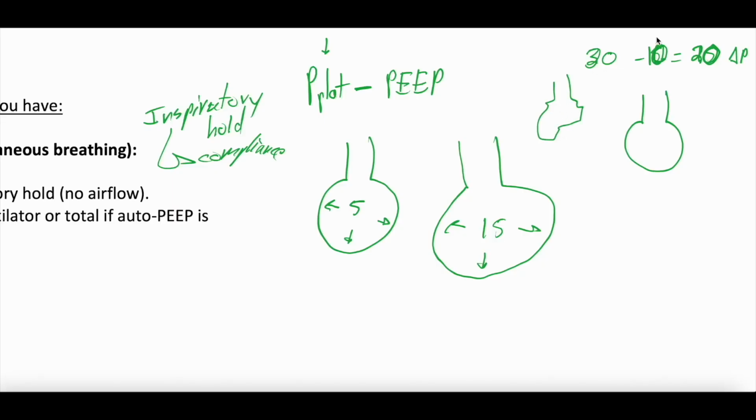So what I'm saying is, I think if I go up on the PEEP, that will cause the alveolus to be perfectly distended, which means that the plateau pressure won't really change, because I'm just going from kind of an underdistended, shriveled down alveolus to a normally distended alveolus. So what this would look like is I increase the PEEP from 10 to 14, and I let that PEEP take hold, and then I check another plateau pressure. And that plateau pressure maybe is 30 again.